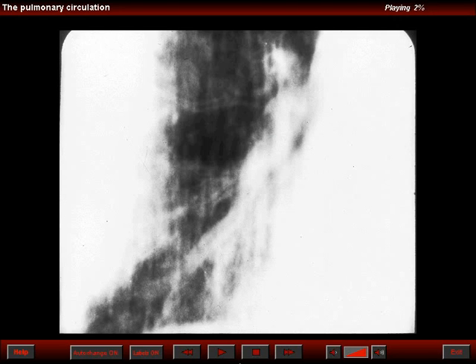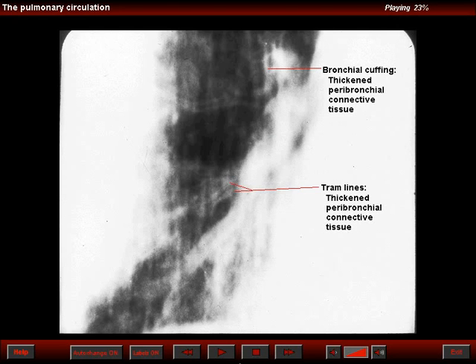Standard tomography can elegantly depict the thickening of the bronchi. You can see the tram line effect in the right base, and you can see a bronchus with wall thickening as seen on end. The reason for these two findings is thickening of the axial connective tissue.